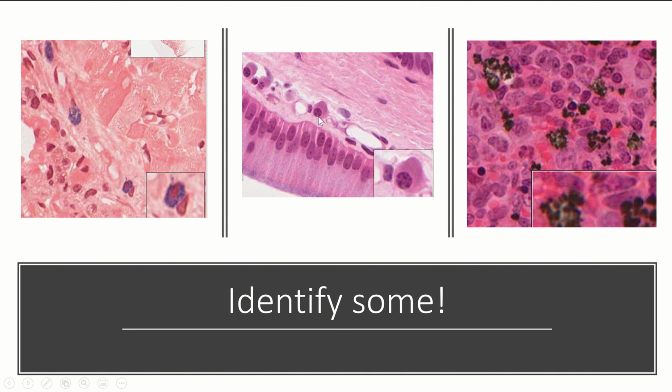Okay, here. So this cell right here, it's got that perfect nucleus, and then some big pink cytoplasm kind of floating on either side of it, right? So it looks like a cracked egg. That's a plasma cell. And remember we said those produce antibodies, okay?